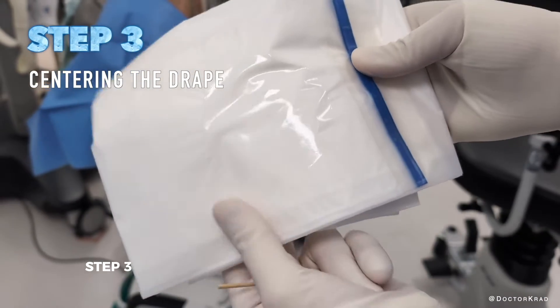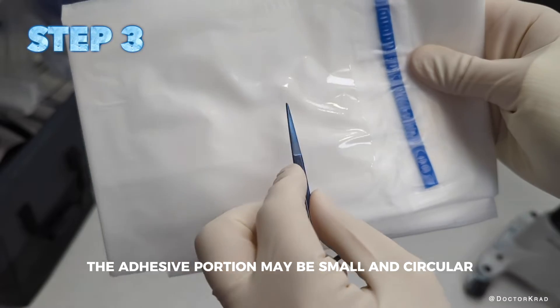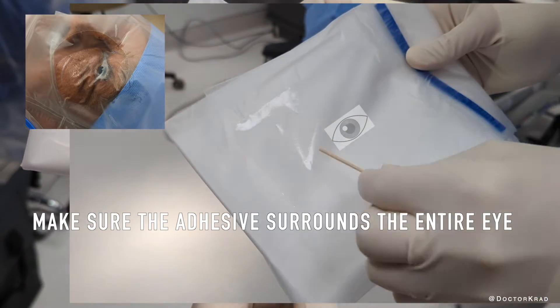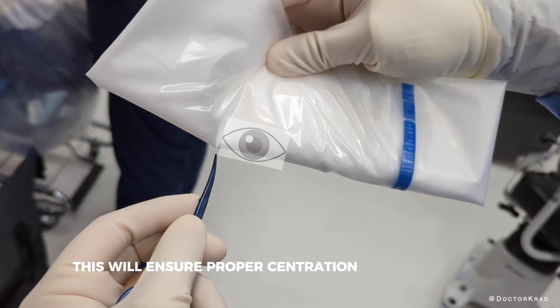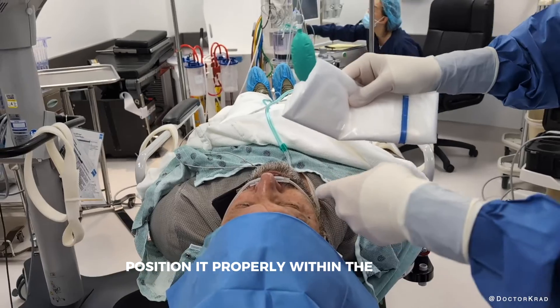Step three: inspect the adhesive portion of the drape. The adhesive portion may be small and circular, and sometimes it's large and rectangular. Assess where the eye will ideally be positioned. Create a fold where you expect the medial canthus to be. This will ensure proper centration of the adhesive, and it will also create rigidity in the drape, which will help you position it properly within the eyelids.